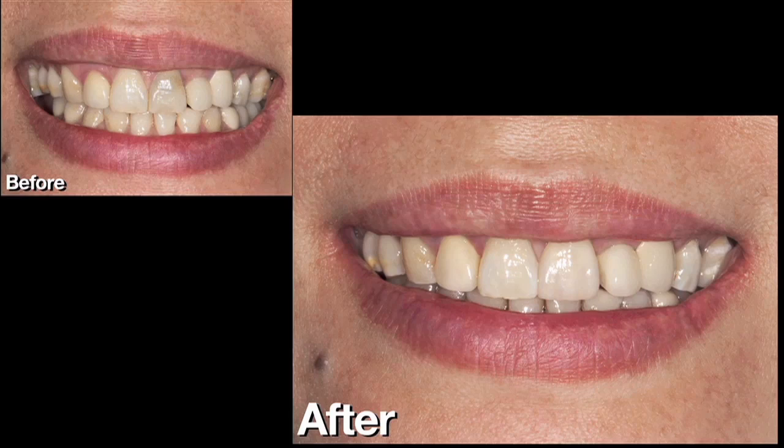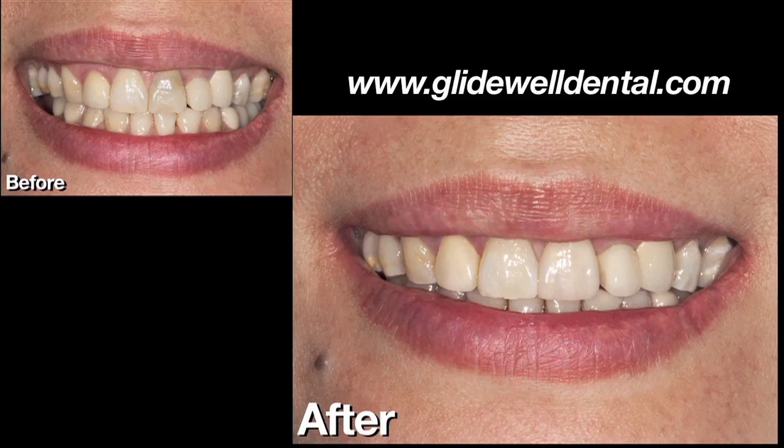That said, if I was out in private practice and doing a single crown like this without an in-office technician, I would do an Emax crown there. No questions asked. It's just going to be easier to get that to blend in. But we started noticing doctors prescribing anterior Bruxer, and I thought, you know what, I better do some of these and see how it works. It works certainly very well, especially when you have an in-house technician.